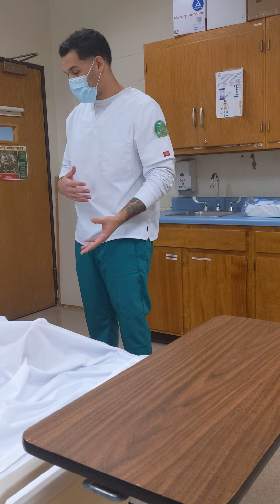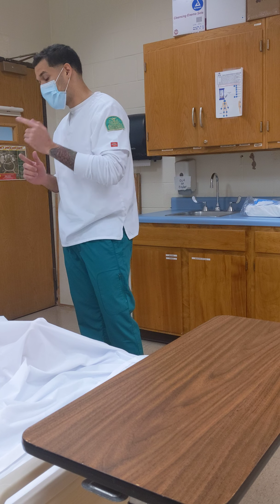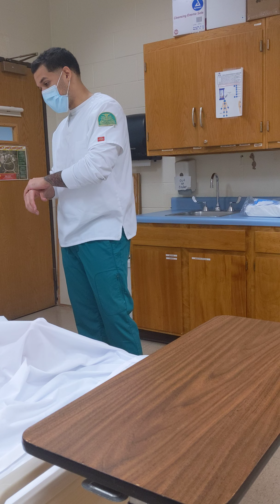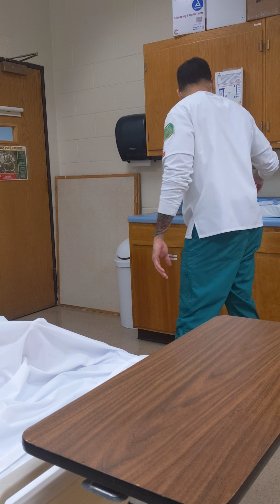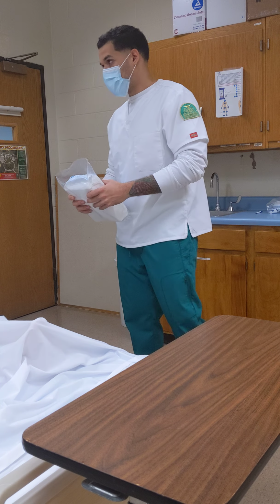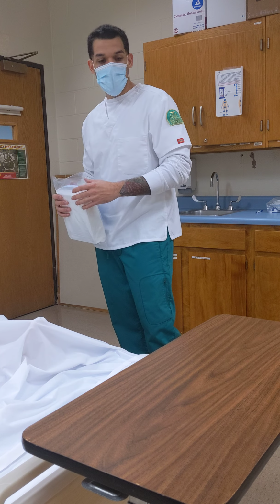After the client has given me the name and date of birth, I would then do hand hygiene first before I touch them. Check the wristband to confirm the identification, and then begin to explain that I'm going to be providing this catheter for post-surgery or for any urinary incontinence reasons.